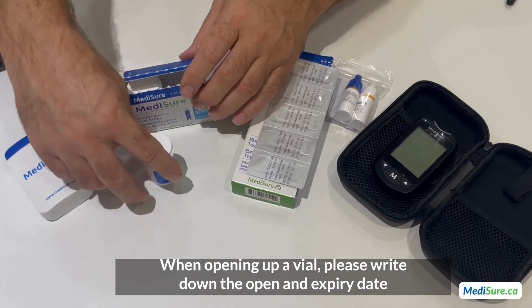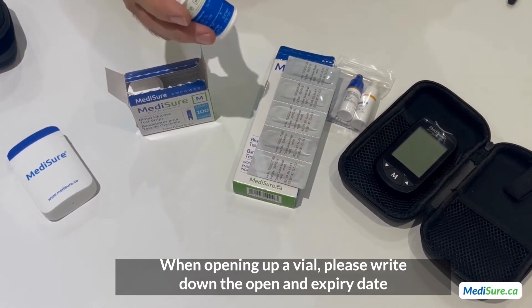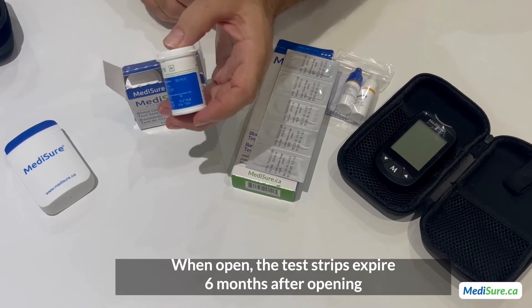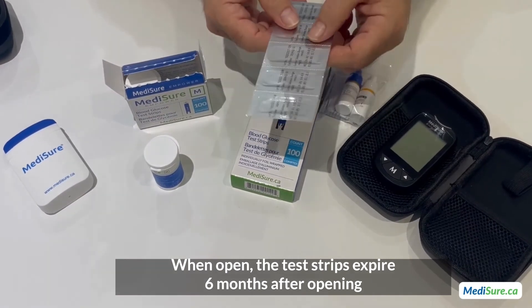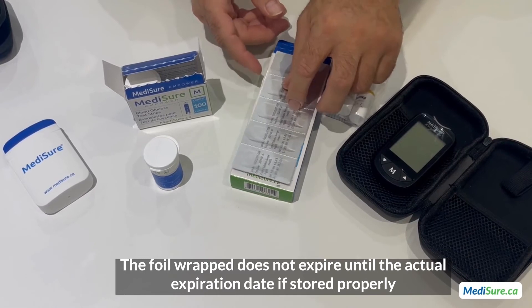When opening up a vial of test strips, please write down the open expiry date. When open, the test strips expire six months after opening. The foil-wrapped strips, by virtue of the fact that they are individually wrapped, do not expire until the actual expiry date if stored properly.